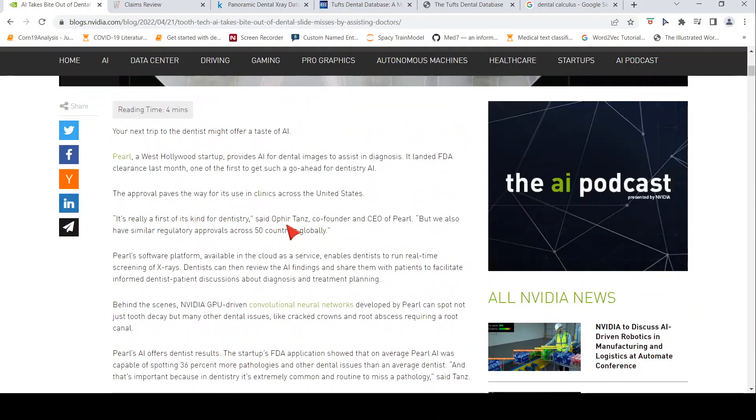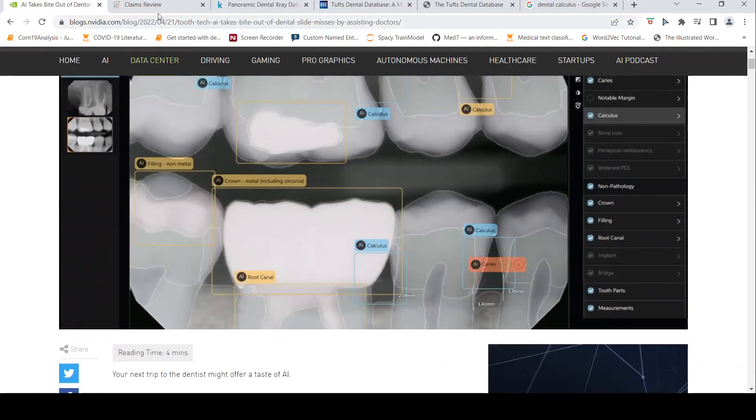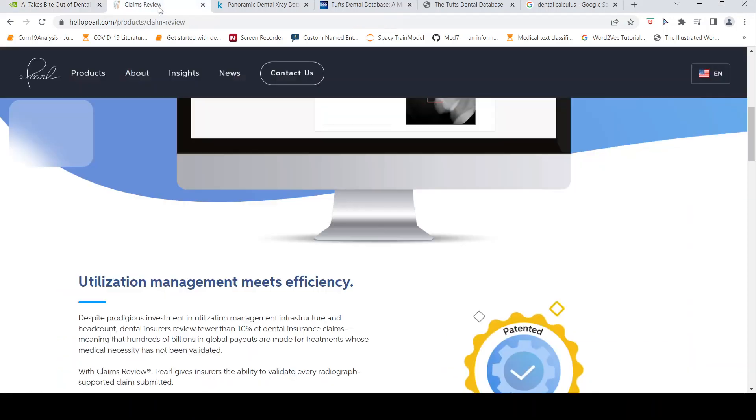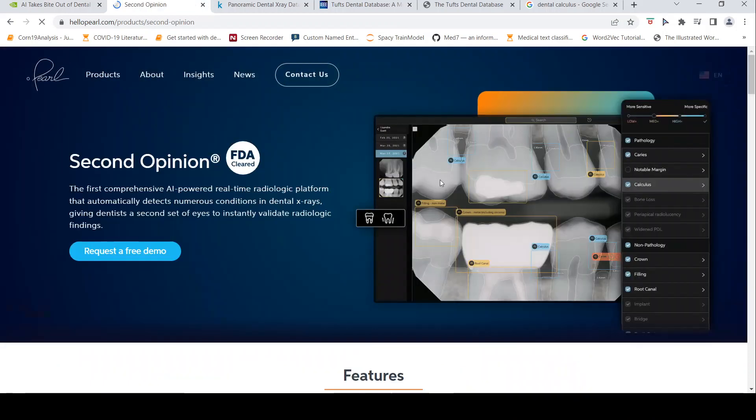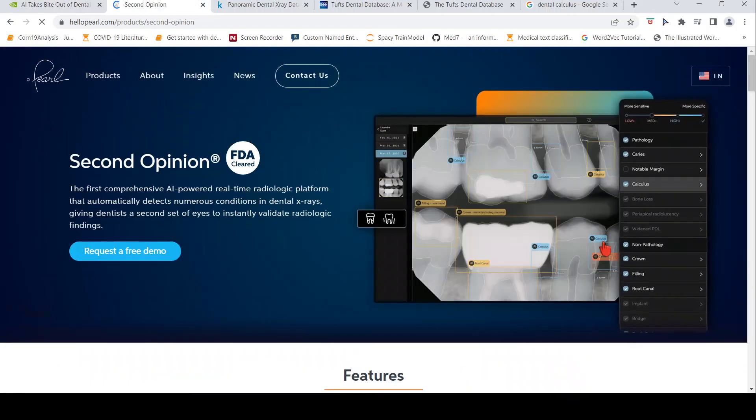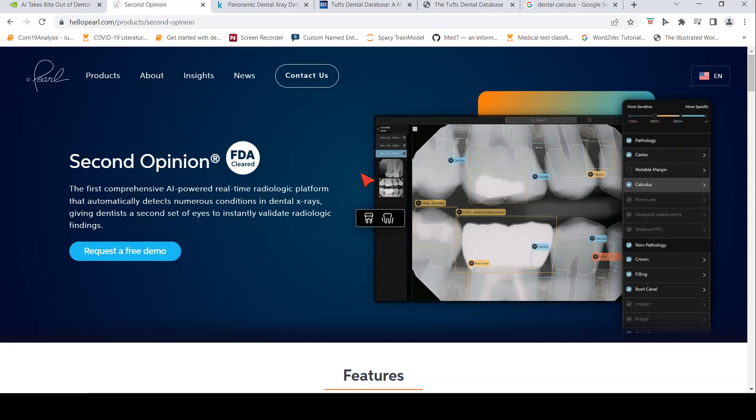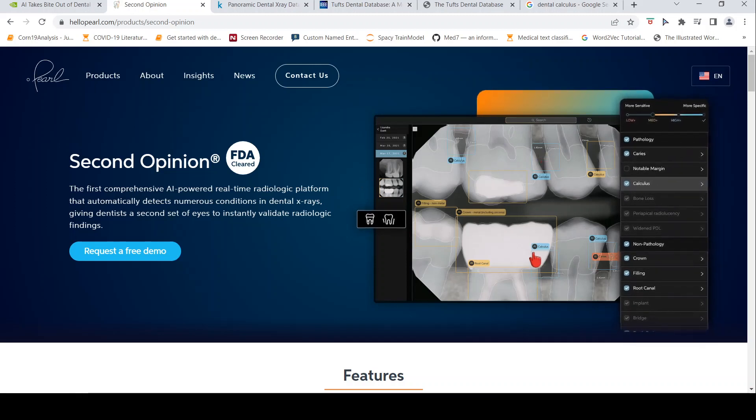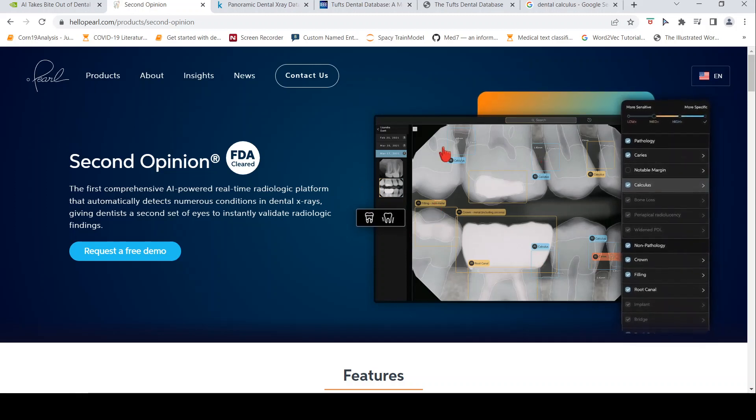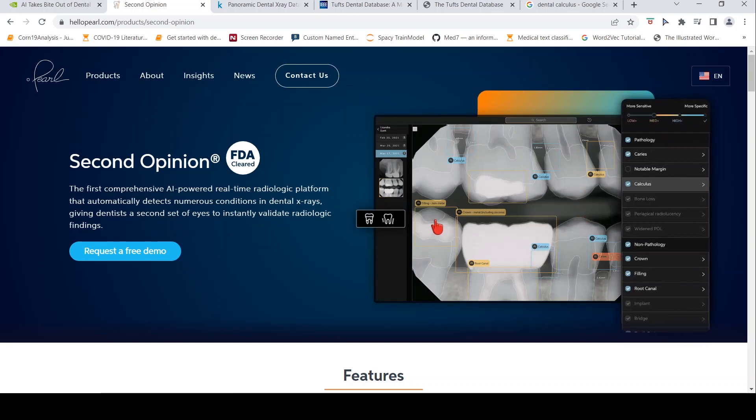Now I went and looked into this particular website to identify what kind of products they have. Basically, this startup Pearl. One is the second opinion, your AI assistant, which provides these detections on the X-ray images.